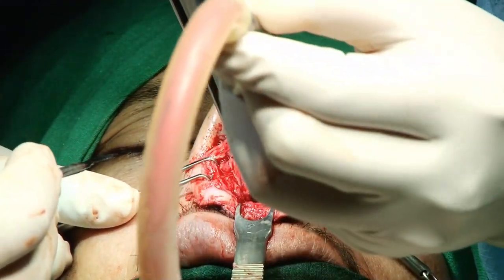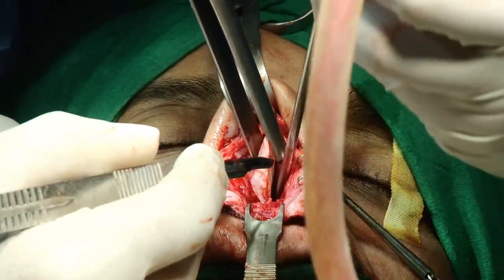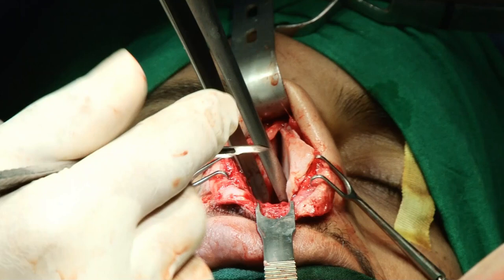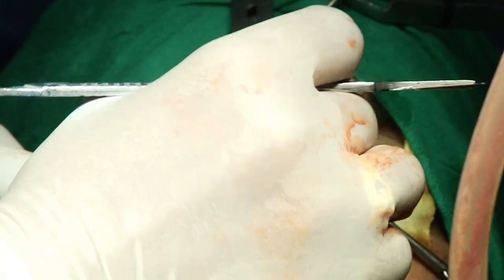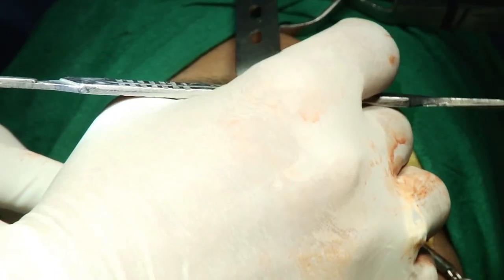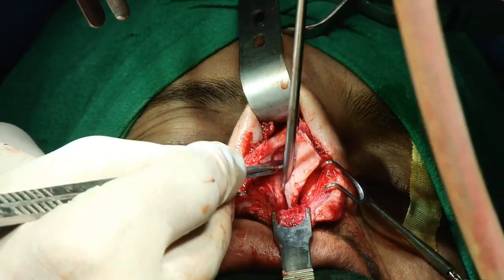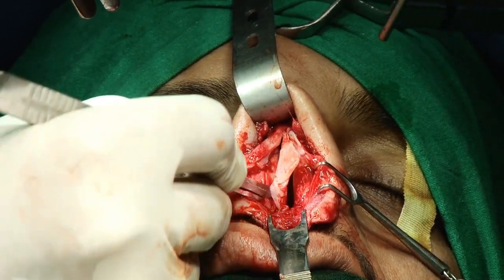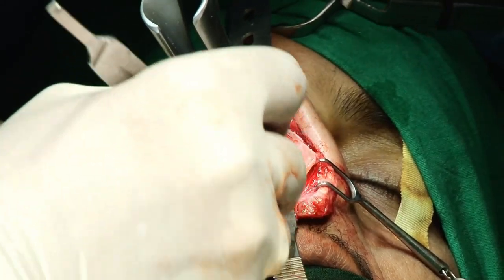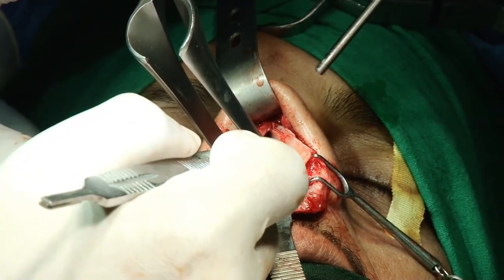Before you remove, can I ask you a question? Yes. The part that is completely bent? Yeah. This bending part will definitely be corrected, but first we harvest. This bending we correct later by making an incision, removing a wedge of septum here and then we put a batten graft for correction of this bending. So now I go down and change the position and then go posterior, completing this incision.